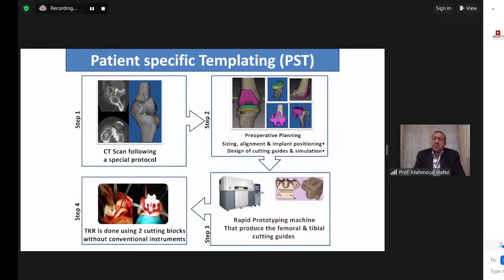They are based on surface matching. So the femoral template will fit on the distal femur. It usually gets into one position, and once it is in this position, you fix it with wire, and that's it. You are perpendicular to the mechanical axis, and the same for the tibia. So you first have these templates virtually inside the computer, and then we have to take them to theater.